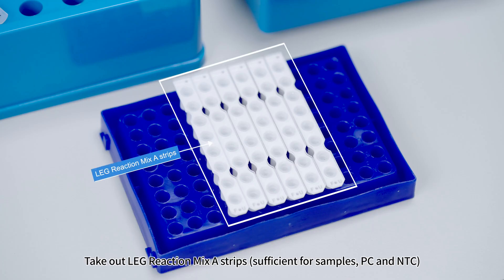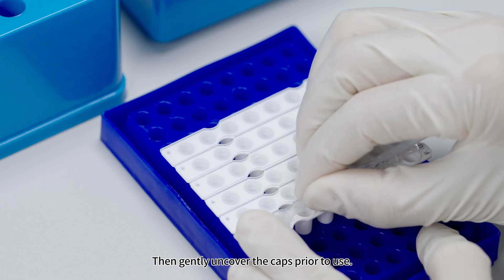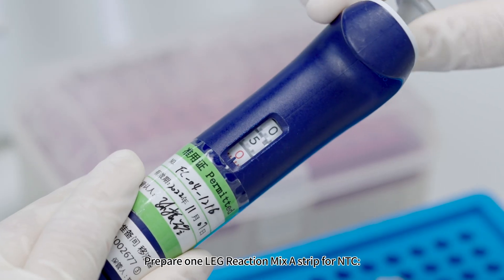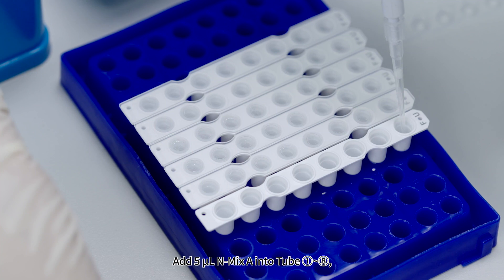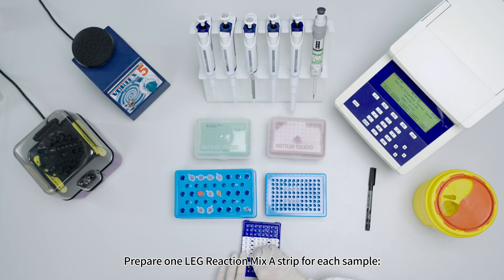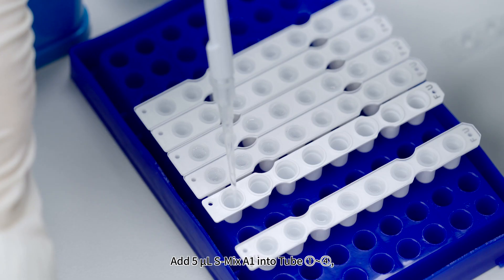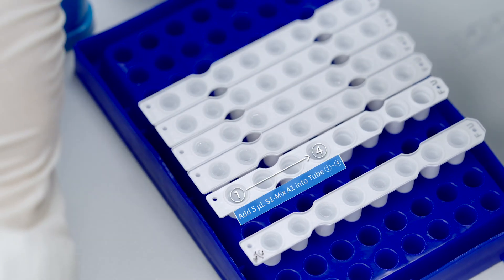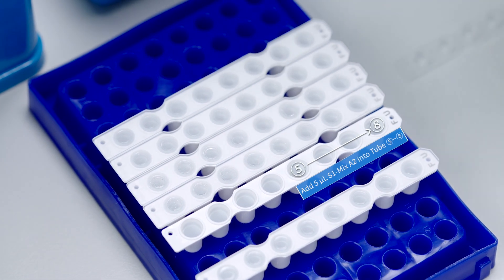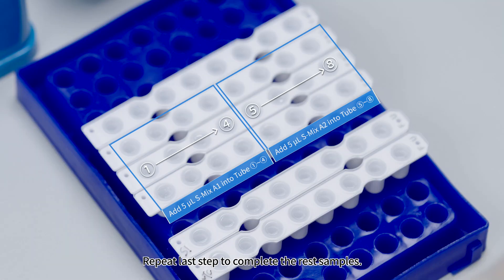Take out LEG Reaction Mix A strips sufficient for samples, PC, and NTC, and centrifuge for 5 to 10 seconds. Gently uncover the caps. For NTC, prepare 1 strip and add 5 microliters N-Mix A into tubes 1 to 8, then cap. For each sample strip, add 5 microliters S-Mix A1 into tubes 1 to 4 and 5 microliters S-Mix A2 into tubes 5 to 8. Cap and mark as S1. Repeat for remaining samples.